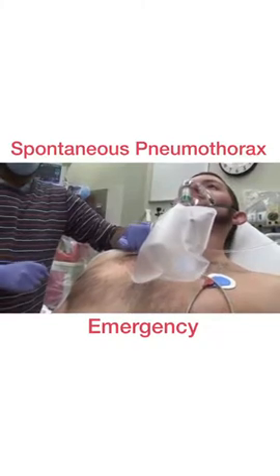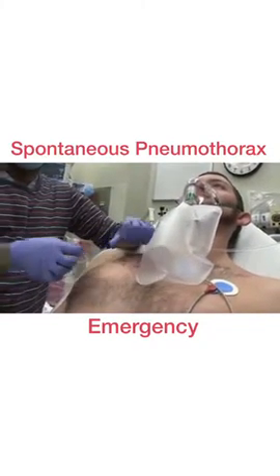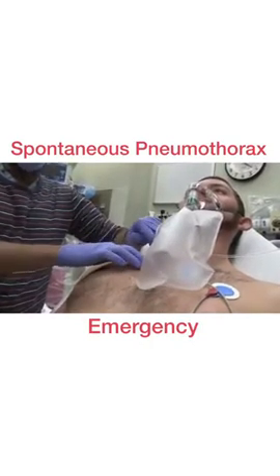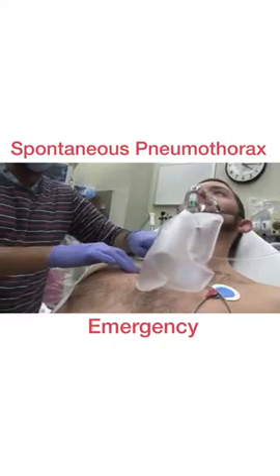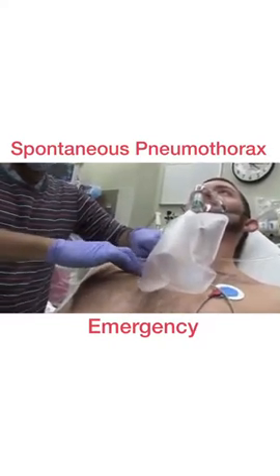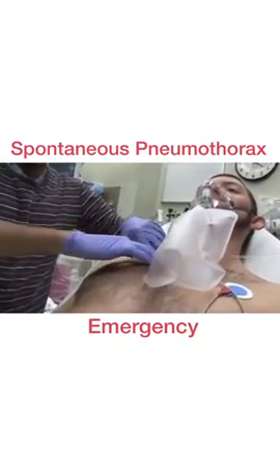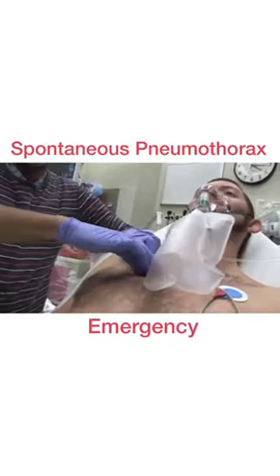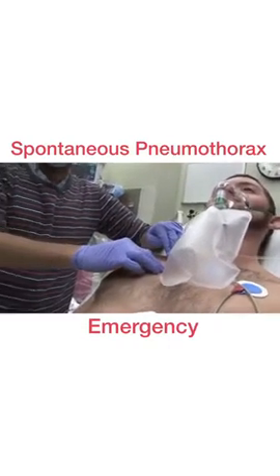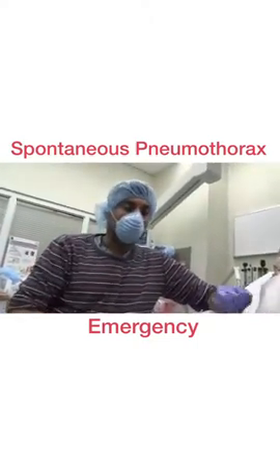It's a chest tube that actually fits onto the chest as an apparatus and doesn't require the atrium, can be just hooked up to low intermittent suction directly to our wall suction. So he can get up and actually walk around after he's had this placed. That's correct. And for a stable pneumothorax, this is the ideal, meaning a patient who has no respiratory distress or profoundly hypoxic crashing. This is the procedure of choice.